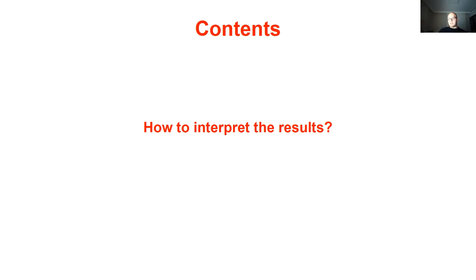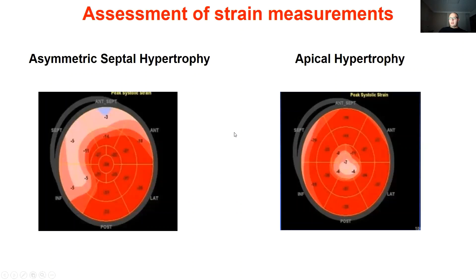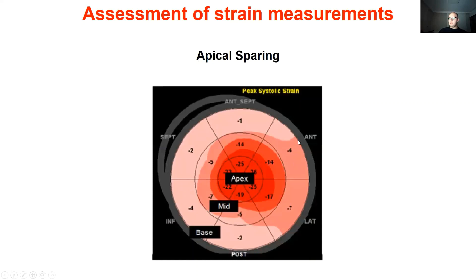Here are some examples for interpretation of results. In a patient with anterior myocardial infarction, the strain traces show that segments in the anterior wall and anterior septum have reduced absolute strain values, and GLS is also reduced. For segmental analysis, pattern recognition is more important, as at the segment level speckle tracking has low reproducibility. In a patient with asymmetrical septal hypertrophy, strain values of the septum are reduced; in a patient with apical hypertrophy, there is a zone of reduced strain in the apex.